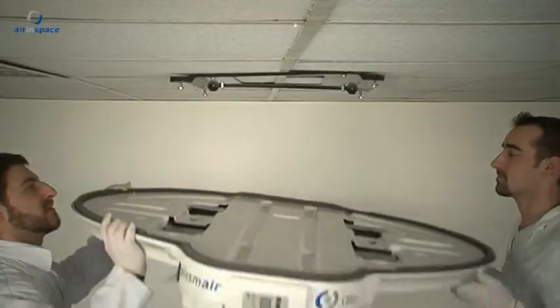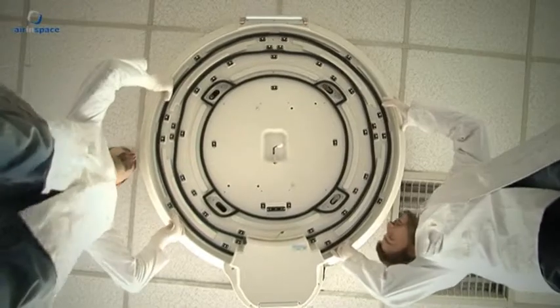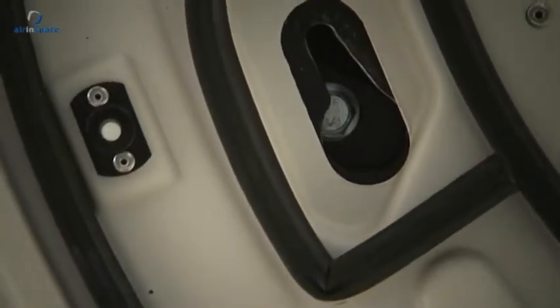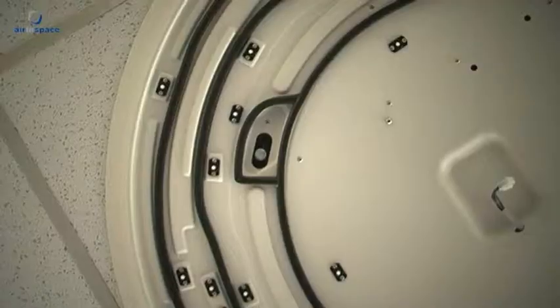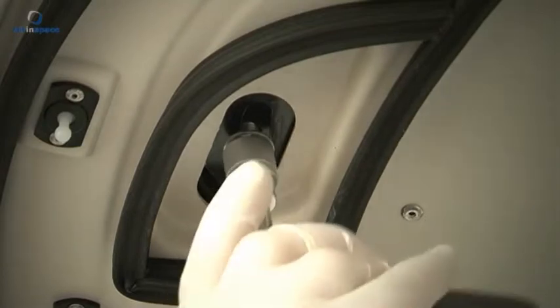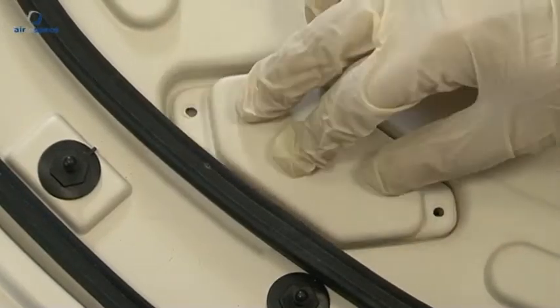Mounting the main base: The base contains four keyhole-shaped holes for positioning and fixing the unit. Position the base beneath the plate so that the heads of the bolts on the plate are in line with the holes in the base. Turn the base counterclockwise until the bolts are blocked at the narrow end of the keyholes. Use a 13mm spanner to tighten the nuts, then cover the four nuts with cover caps.